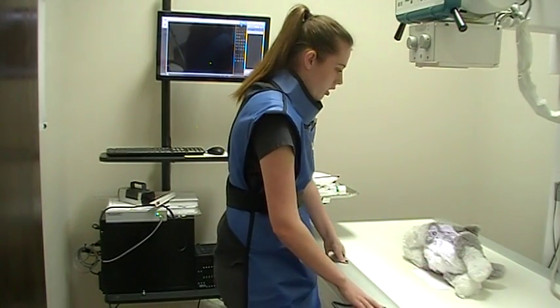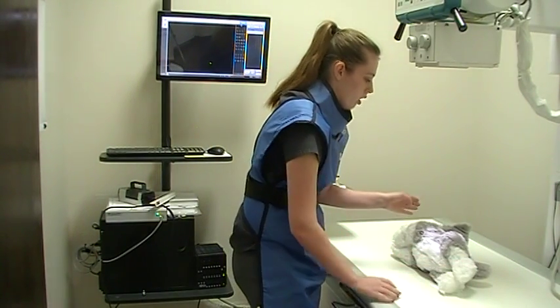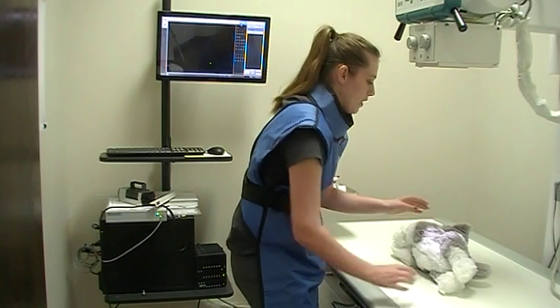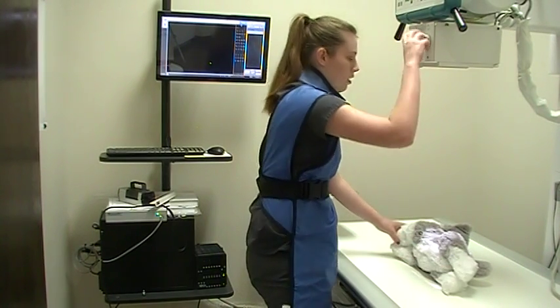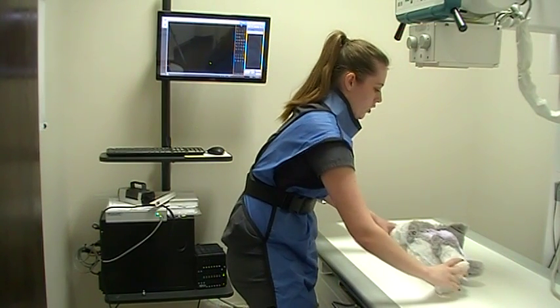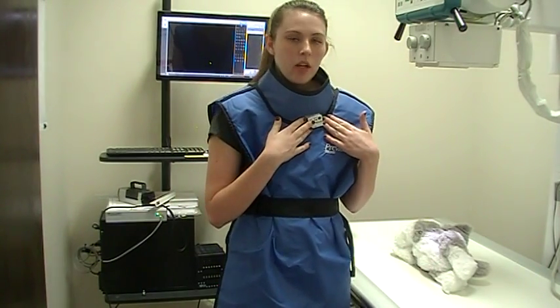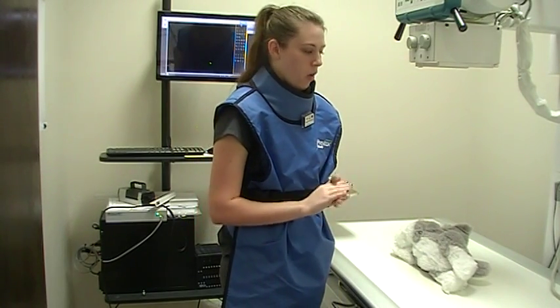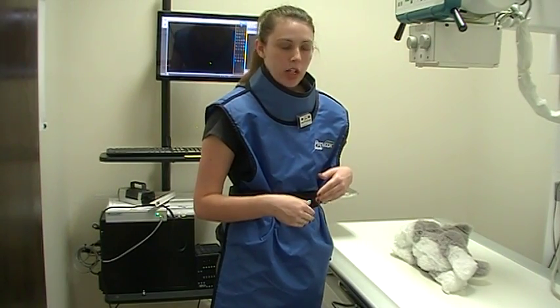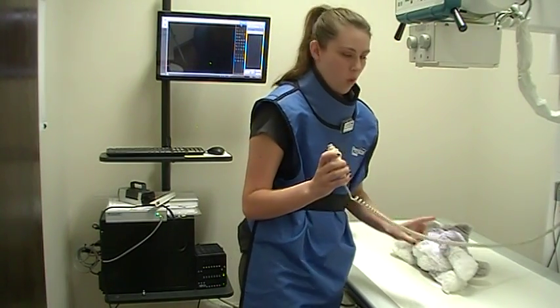We are going to turn on our x-ray light and we want to properly collimate for a lateral abdominal view, which would be from T9 all the way down to the acetabulum. As you can see I have my proper lead gown, thyroid collar, and dosimeter badge. Because our patient is under some sedation, I am not going to wear my lead gloves. I am actually going to go behind a wall to decrease some of the radiation exposure.